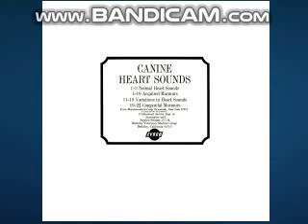The second heart sound is shorter and of higher frequency than the first sound. It is best heard over the pulmonic valve. Listen to a normal dog's heart sounds recorded over the pulmonic valve.